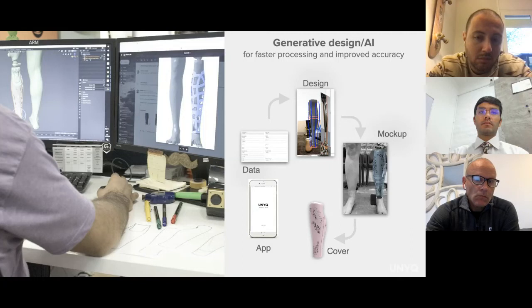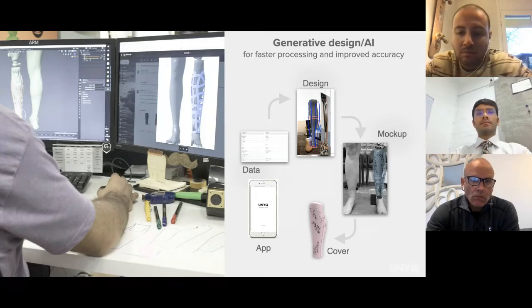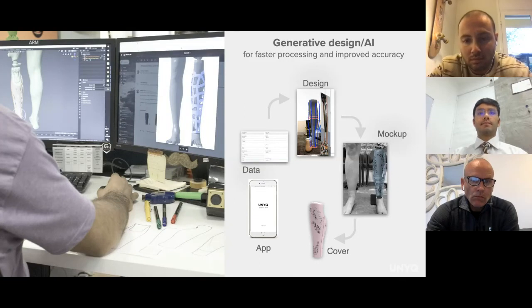So sometimes, for instance, the components themselves are wider in the ankle than your anatomic sound limb. And then, of course, it's important for the patient to understand that it's impossible to be narrower than the components beneath the cover. But this is something that you can show, and if you want to change, they can give us information, and there are also different options if you want to have the knee joint open or covered. We will show alternatives, and the patient can be fine knowing exactly how it will look before we go to production.